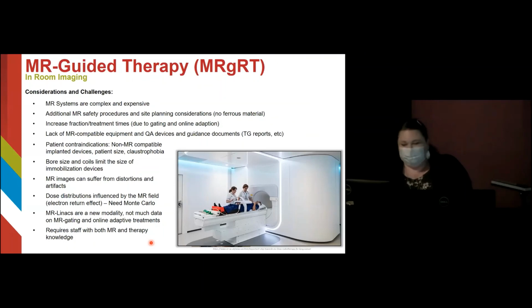While MRI-guided therapy is very exciting, there are some challenges. MR systems are complex and expensive. Treatment times will likely be longer if you're using gating or online adaptive treatment. There are patient contraindications like implanted devices, patient size, claustrophobia. MR images can suffer from distortions, and also the dose distribution can be influenced by the magnetic field. And then probably one of the most important challenges is that these machines require staff to be knowledgeable in both MR and therapy. And conventionally, there's been some separation between diagnostic and therapeutic staff. So I think this distinction is going to be more blurred as time goes on.